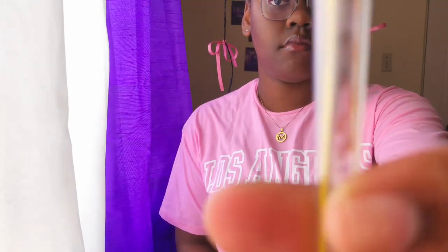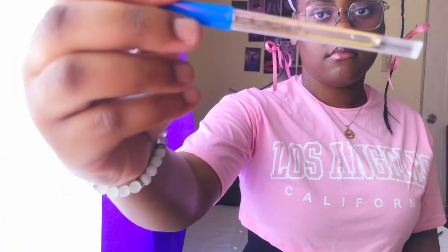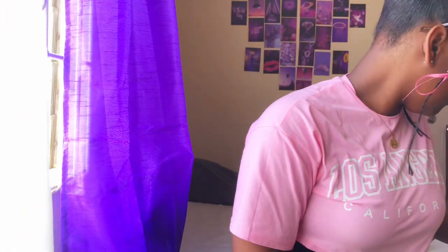The next item is the thermometer — everybody knows this one. The thermometer is used to measure a person's body temperature accurately, so you can continue with your procedure accordingly. As you can see, I have a glass thermometer here — you have to be very careful with it because it is very fragile and can break at any point.